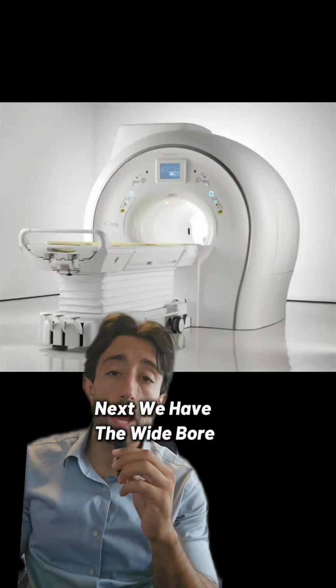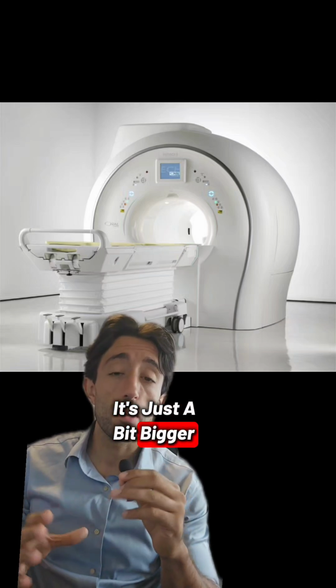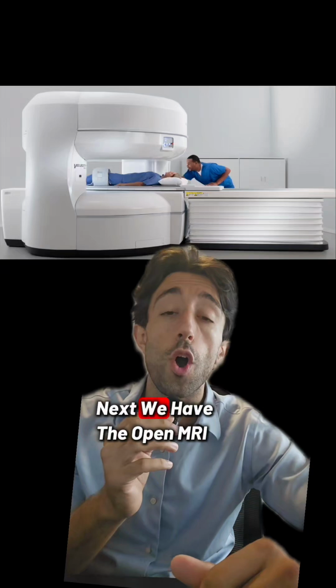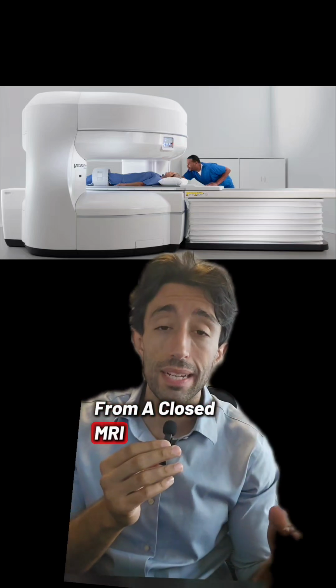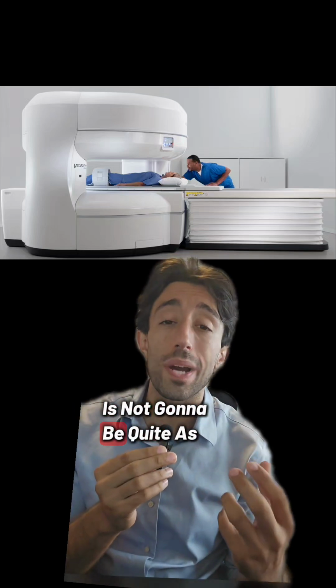Next, we have the wide bore MRI. This is very similar to the closed MRI, but to be honest, it's just a bit bigger, because if someone is maybe a bit broader or a bit bigger of a person, then they need more space that they can fit into the machine. Next, we have the open MRI machine. As it sounds, this is much more open than the closed, claustrophobic feeling that you might get from a closed MRI. However, because of this, usually the quality of the images is not going to be quite as good.